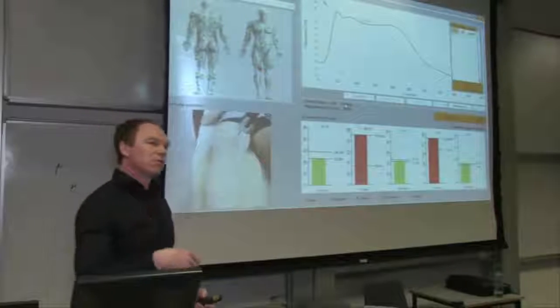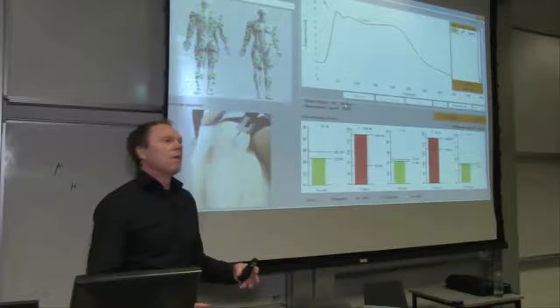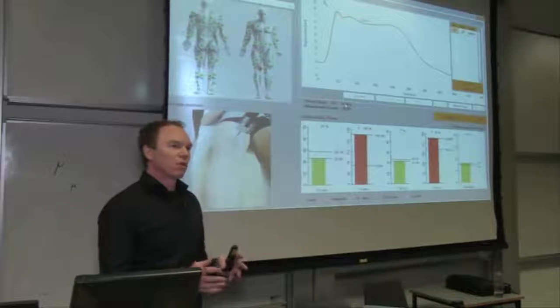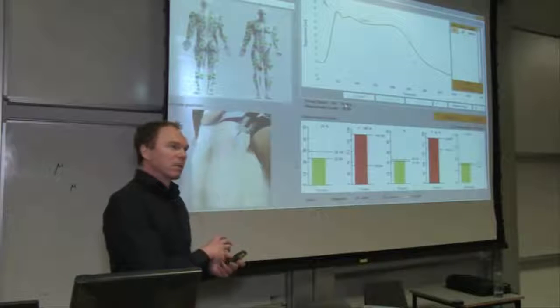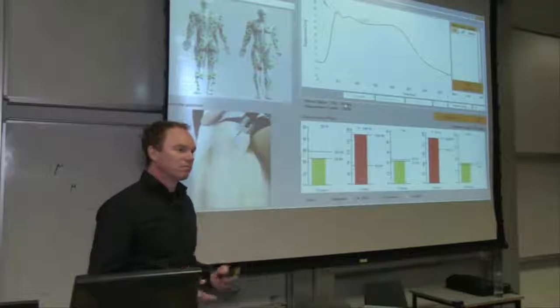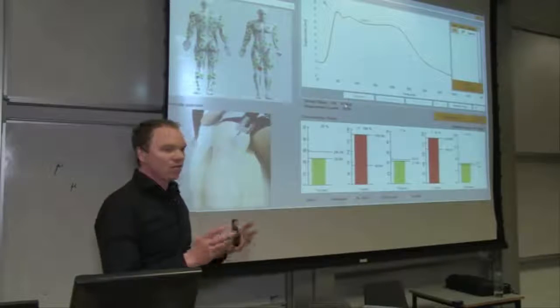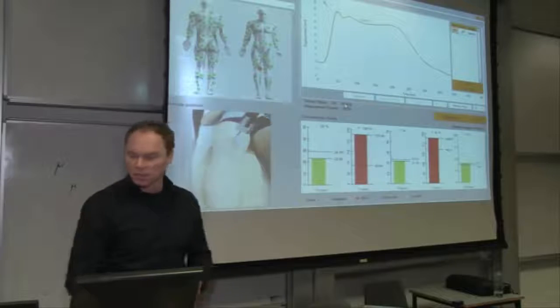Why am I deleting the previous ones? Because when I generate the report, the software will take the average of all the measurements that I have for that muscle. And if I keep the ones with 10, 20, I will just get the average of everything. So I'm interested in the last one. So I'm finished with this muscle. I move on to the next one.